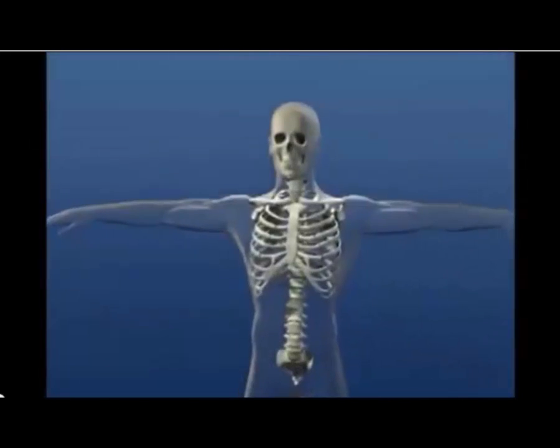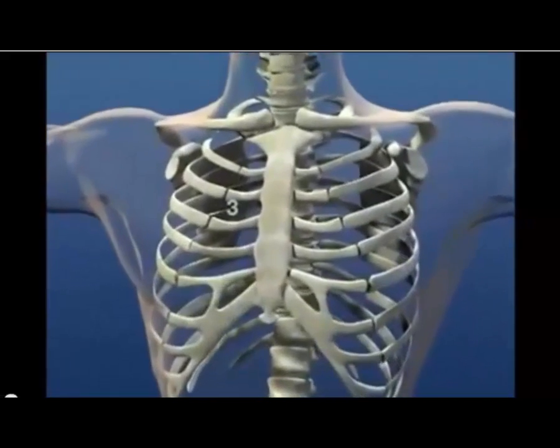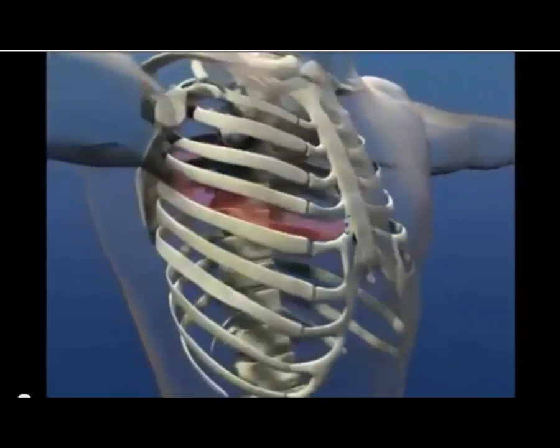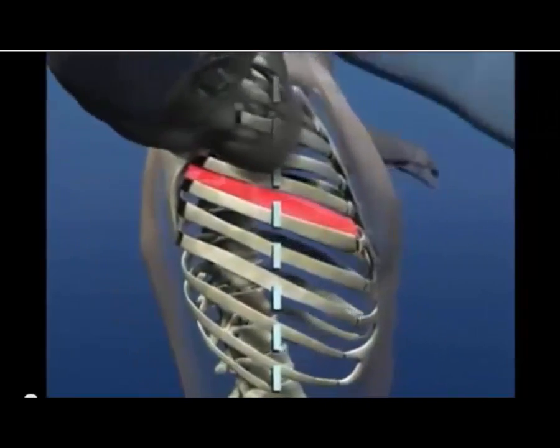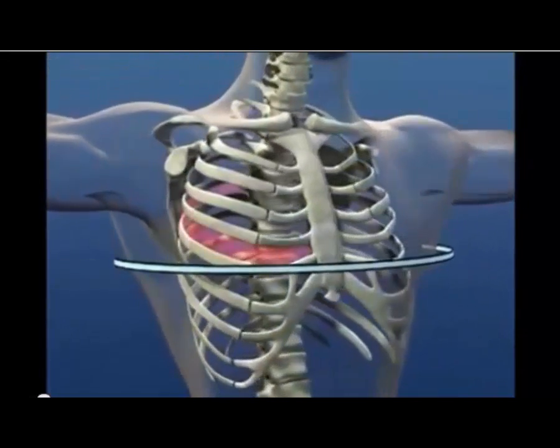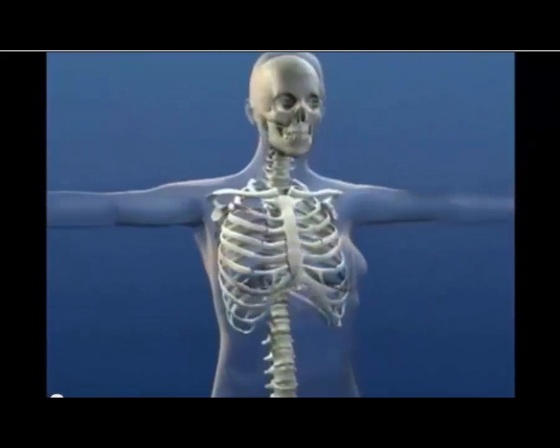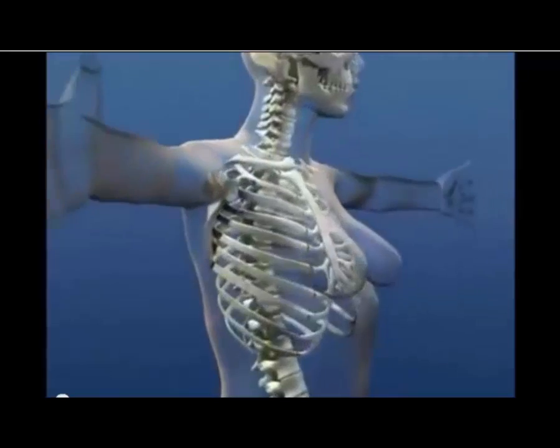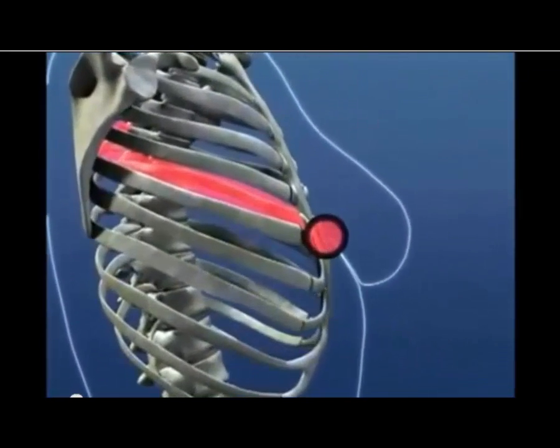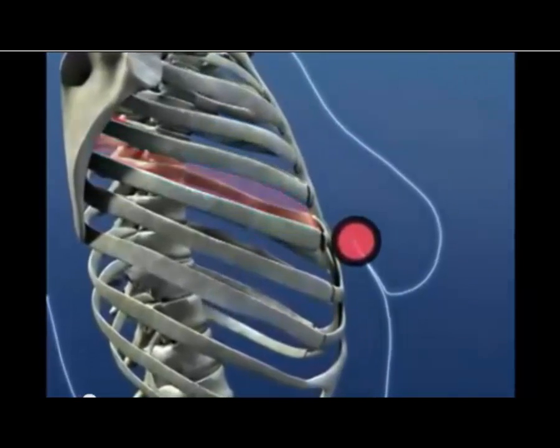The first step in the placement of a chest tube is to identify the insertion site. The insertion site is the 5th intercostal space just anterior to the mid-axillary line on the affected side. This can be found by using the nipple level as a landmark for the 5th intercostal space. In females, always be aware that the nipple may be displaced inferiorly due to large pendulous breasts. In this case, remember to stay above the inferior mammary fold where the nipple would normally lie.